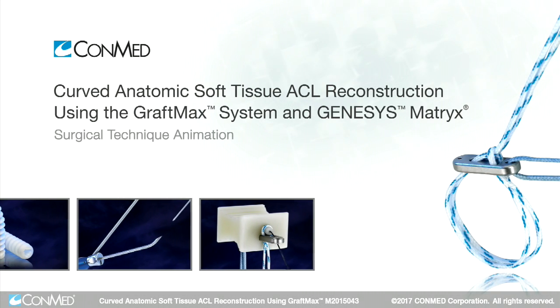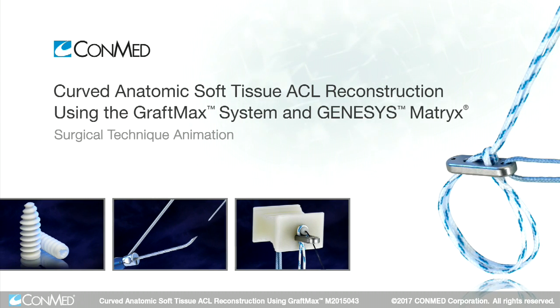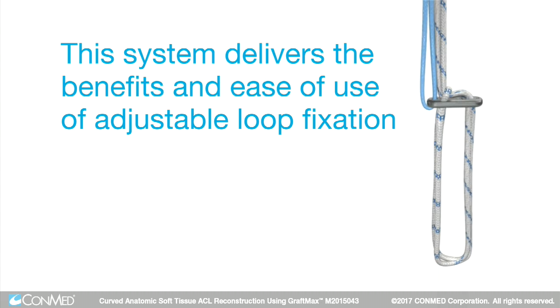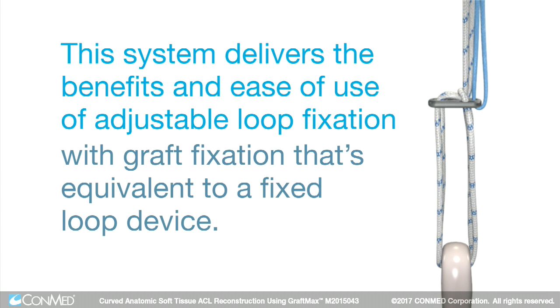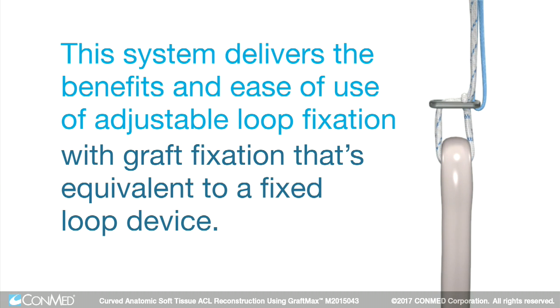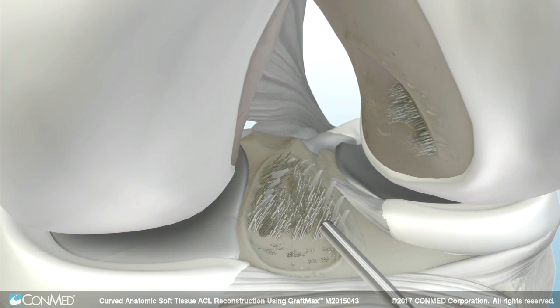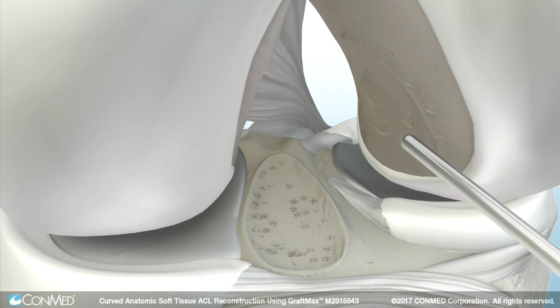The GraftMax button and curved reaming system provides precise anatomic tunnels without the need for hyperflexing. This system delivers the benefits and ease of use of adjustable loop fixation with graft fixation that's equivalent to a fixed loop device. To begin, debride unwanted remnant ACL tissue and mark the center of the desired tunnel locations.